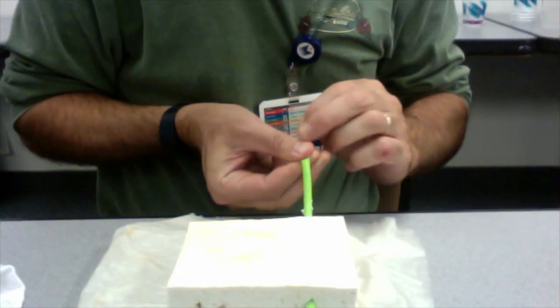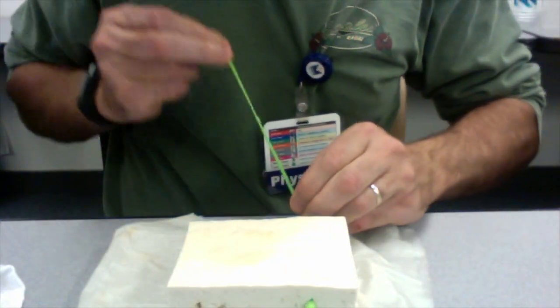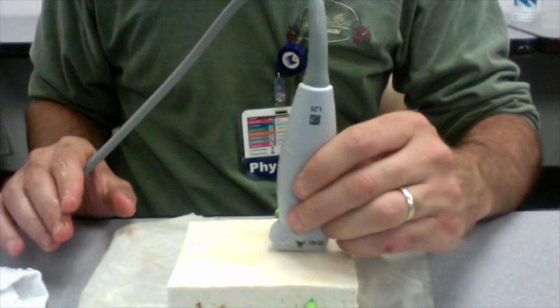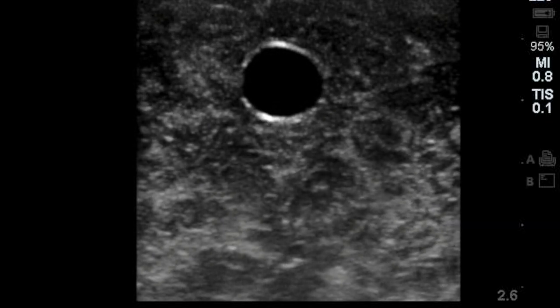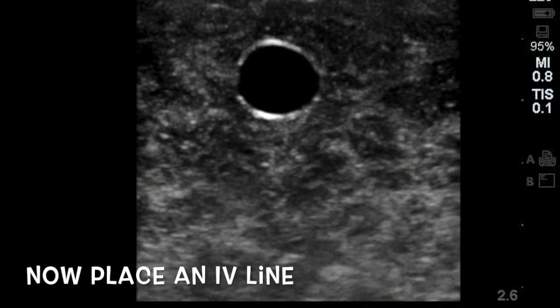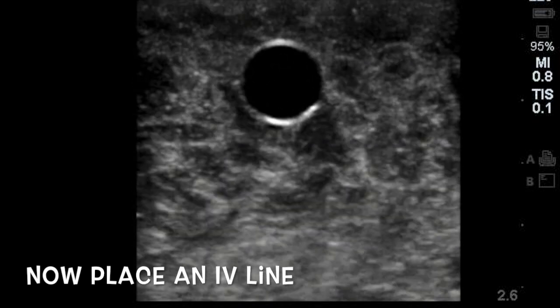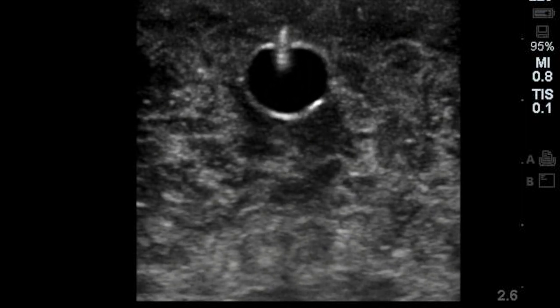Once it's in there, just tie the balloon off, and voila! Take a look with your ultrasound and see what you've got. You can see the vein there — this is actually an image of the model that we just made. Now I'll just place an IV, and I'm doing it in transverse here, so I'm poking the needle in and then just sliding the probe forward and watching it go into the vein.